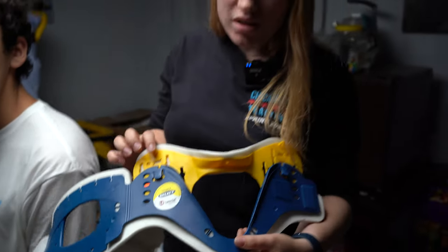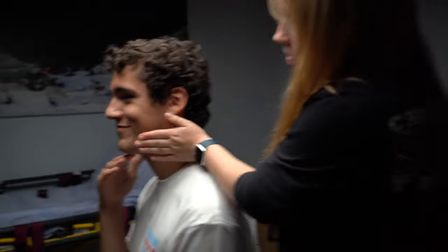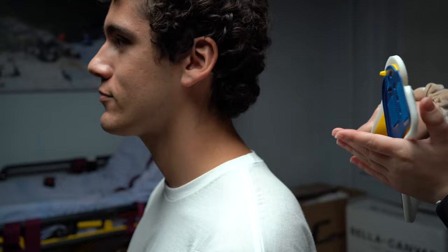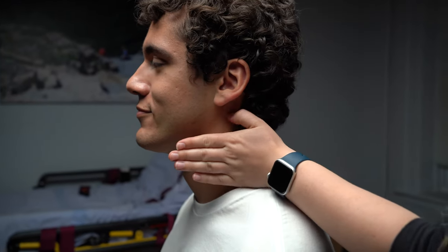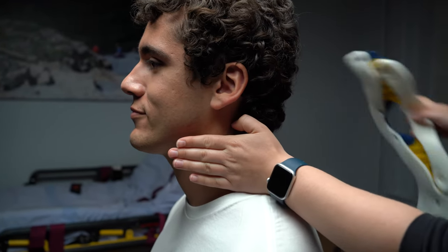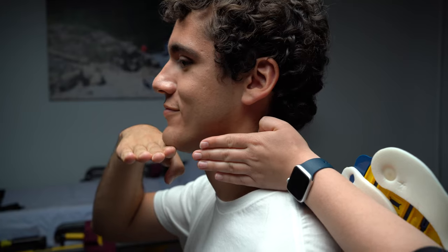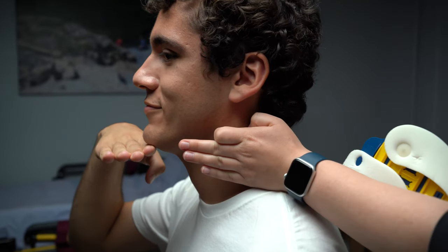To know what size, I'm going to first measure up my patient, Diego. I'm going to take my hand and rest it right up by his neck — that's where the collar is going to sit. I want to find out how many fingers fit from there to the bottom of his chin. Four fingers looks a little too tall, so three looks about right.